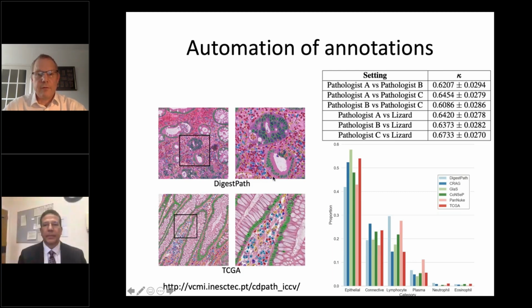And it does seem to, as these images show, quite accurately mark out the areas of acute inflammation in these glands and the distinction between glands of underlying stroma and lamina propria.